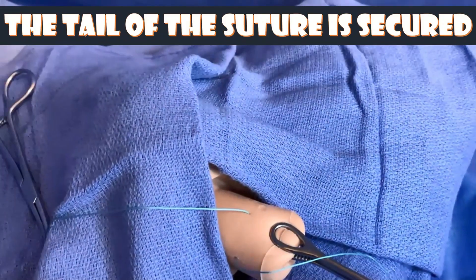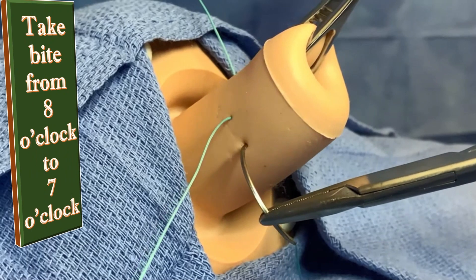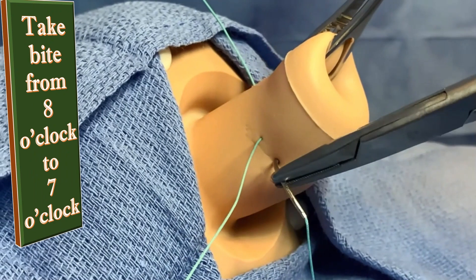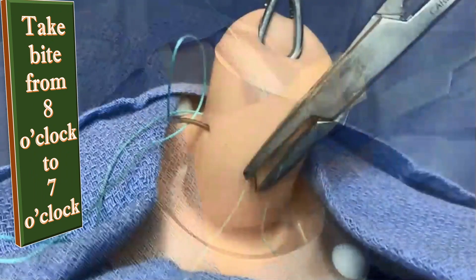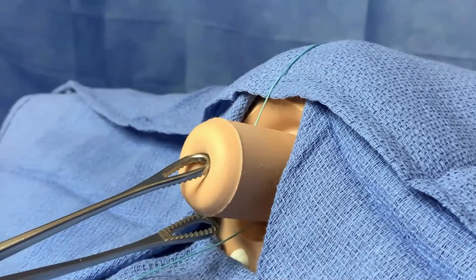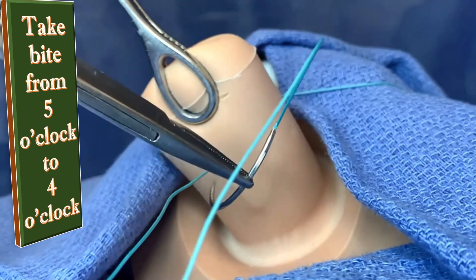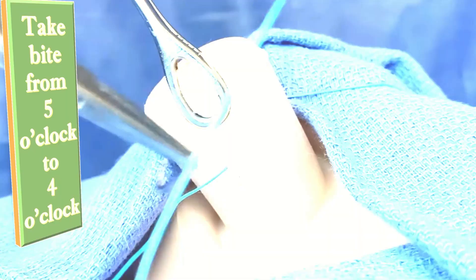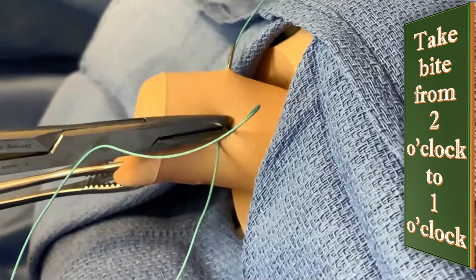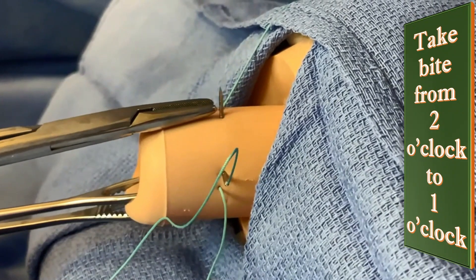After pulling up the cervix with the sponge holder, the next suture is inserted at 8 o'clock and taken out at 7 o'clock. Then hold the posterior lip of the cervix for better traction. Take a bite from 5 o'clock to 4 o'clock position. The last insertion point is at 2 o'clock.